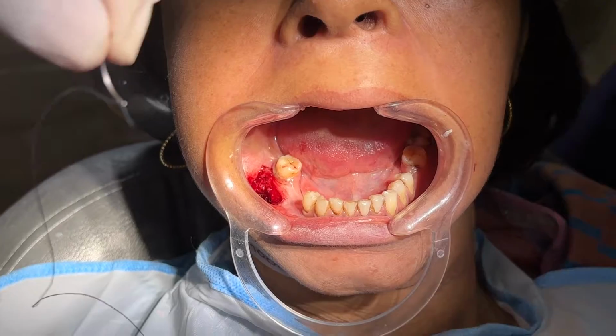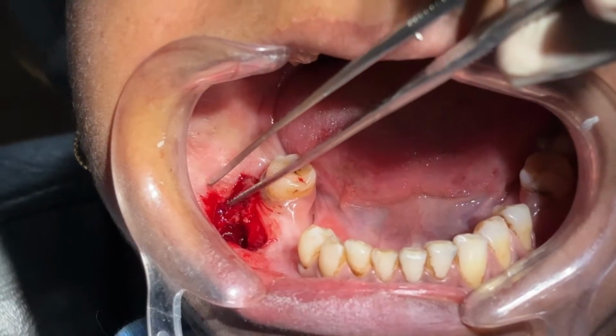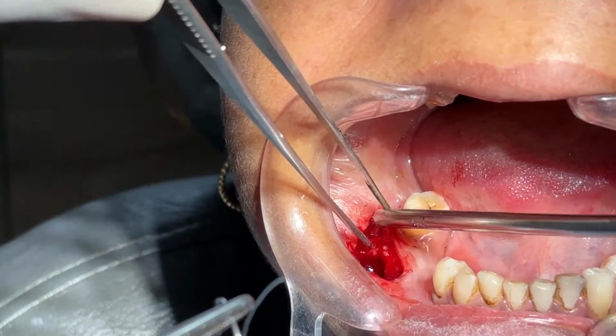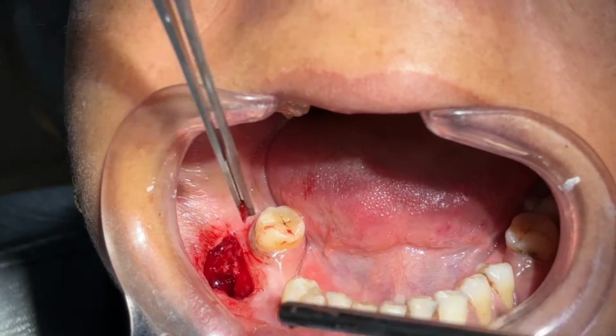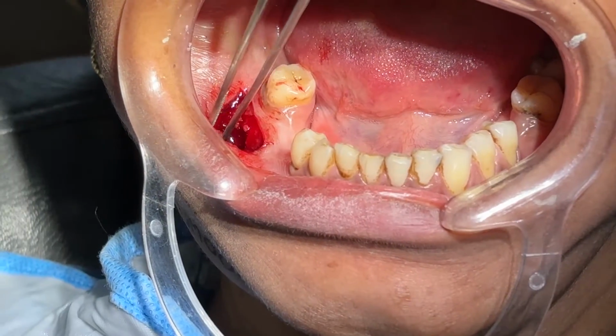So now I will close it. I can use either interrupted or continuous suturing. I will place a simple interrupted suture.